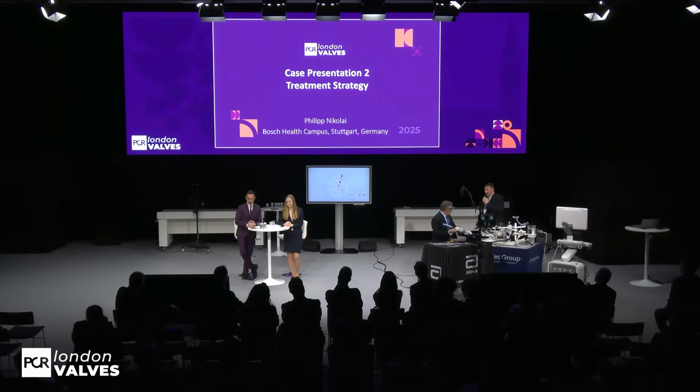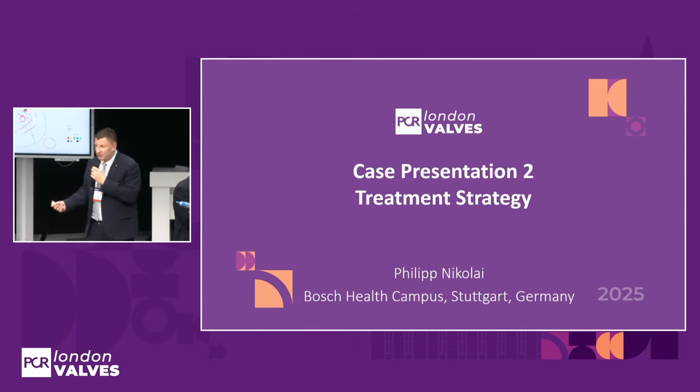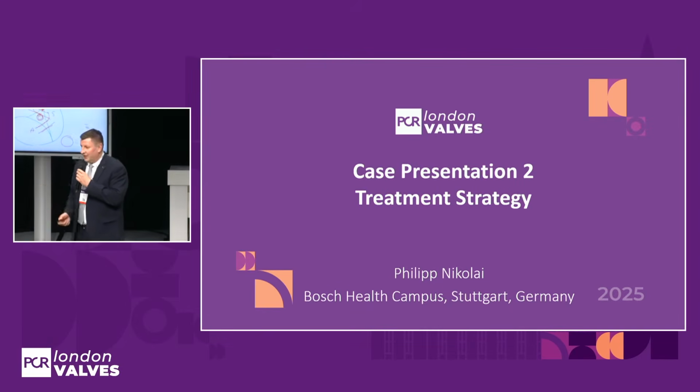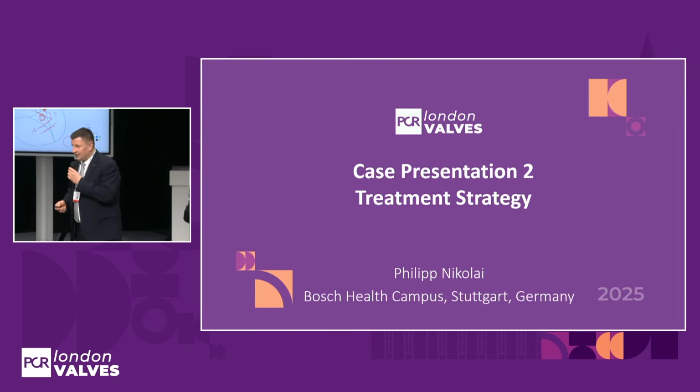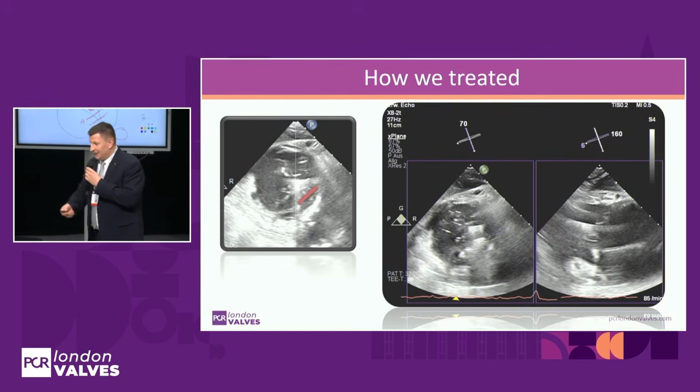So we love the transgastric view. We have no experience with transesophageal view during grasping. We have no experience with 3D during the tricuspid intervention. We love the transgastric view. We love also to grasp in transgastric.